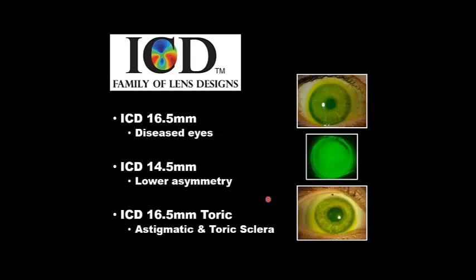Now there's just a couple other lenses we'll spend only a few minutes talking about. There's 3 lenses in the ICD family. The ICD 16-5 is the lens you'll use most frequently. It's the lens that works best on your highly diseased, your corneal thinning patients, your post-refractive surgeries, but you also have an option for a smaller lens. When an ICD 16-5, a 16.5 millimeter lens, is difficult to get in a small fissure patient or a deep set eye, you might find the smaller version of the lens beneficial.